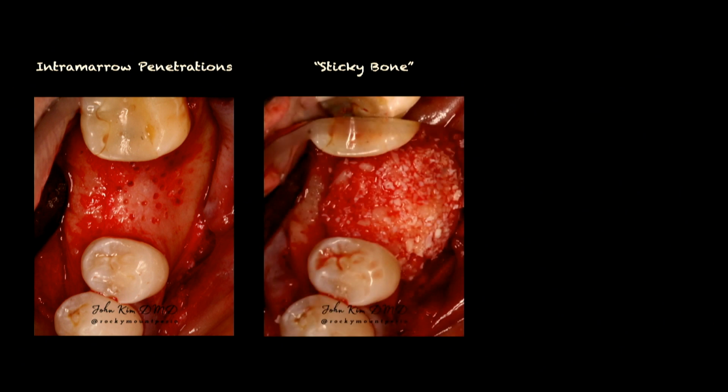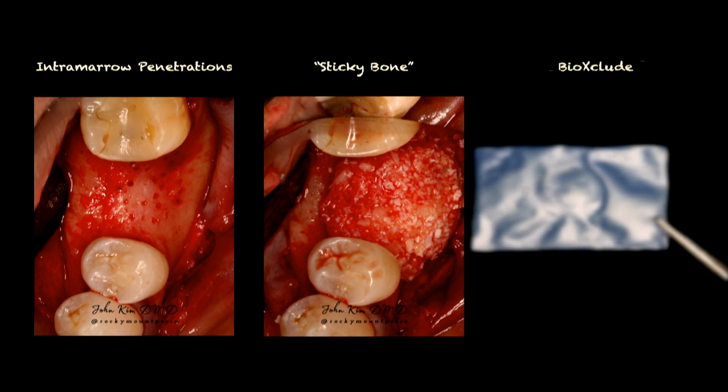And this is what I want to highlight here. Typically, if you're going to use a titanium reinforced membrane or a collagen membrane, you will put the membrane in there first. But with BioXclude, almost always, we'll be putting the bone graft in first. So if I'm doing this without sticky bone and I'm putting that bone graft in there, there's saliva, there's blood, and then you get the floating particles, and it makes for a much more challenging surgery.